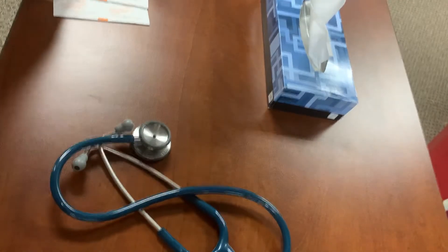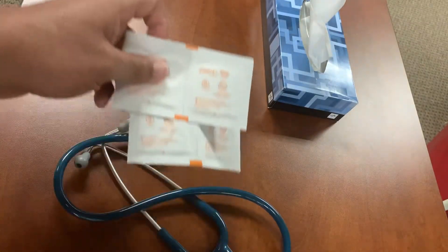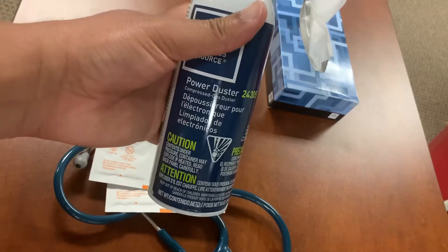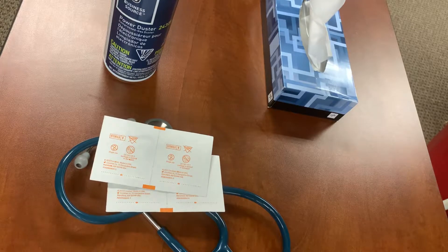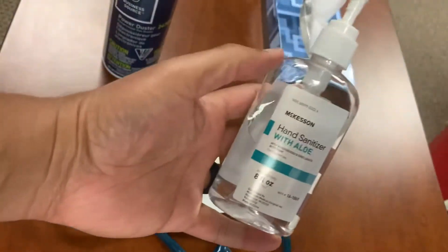I got some alcohol pads, or you can use some rubbing alcohol — that'll probably work as well. And some power duster and hand sanitizer.